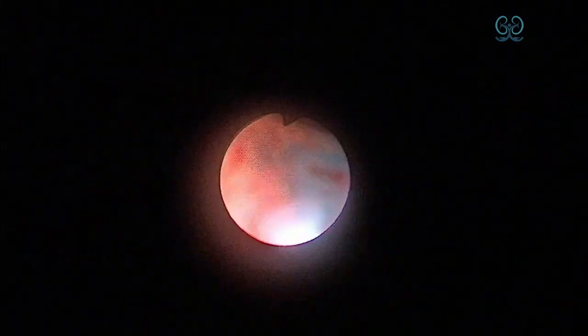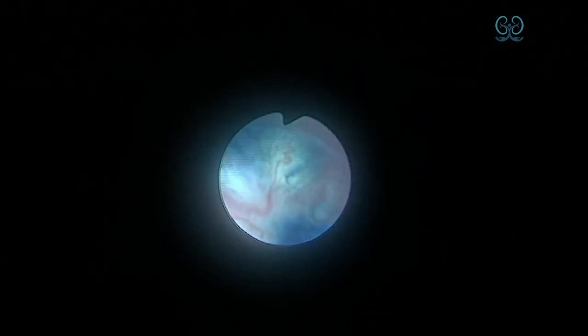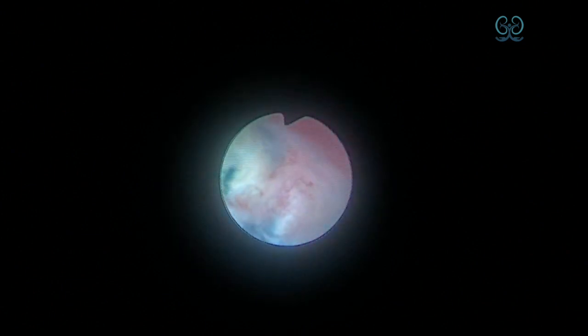We instilled methylene blue into the calyx and then flushed with saline. Later we can see the methylene blue effluxing from the diverticular opening. We can see the efflux here, which is jetting out through a small diverticular opening, which probably we would not have seen without instilling the methylene blue.